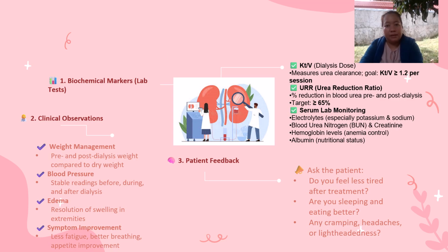Efficacy of dialysis session. How will you know that the dialysis session is efficient? First, you have biochemical markers. Kt/V, the dialysis dose, measures urea clearance. The goal of the Kt/V is greater than 1.2 per session. URR, urea reduction ratio, is the percent of reduction in blood urea pre and post dialysis, which should be greater than 65%.